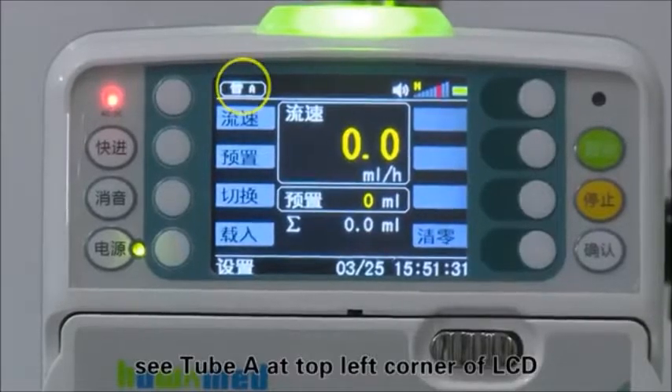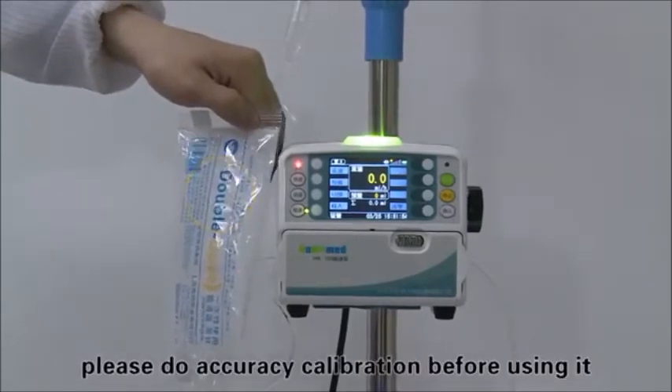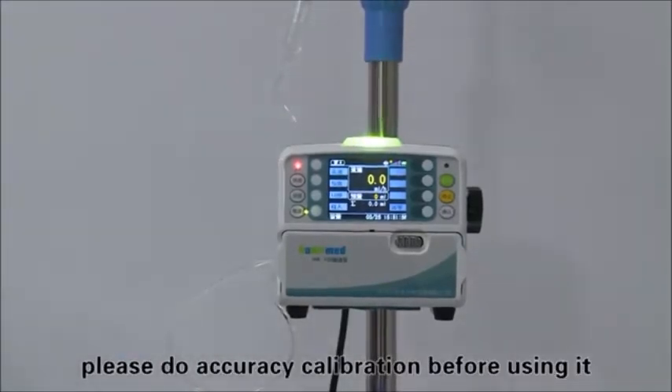You can see Tube A at the top left corner of the LCD. If changing to another brand of infusion set, please perform accuracy calibration before using it.